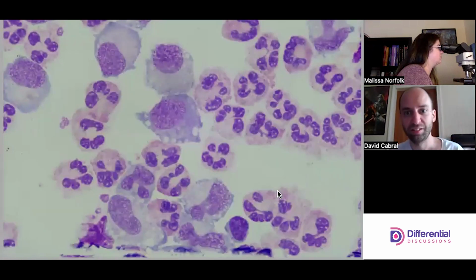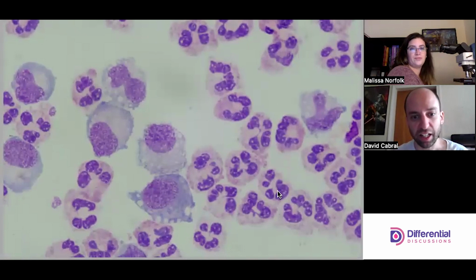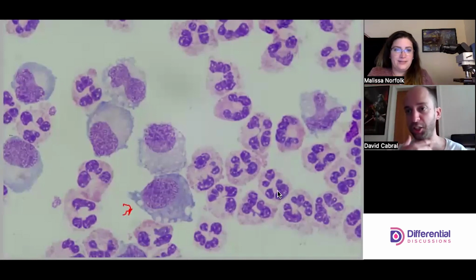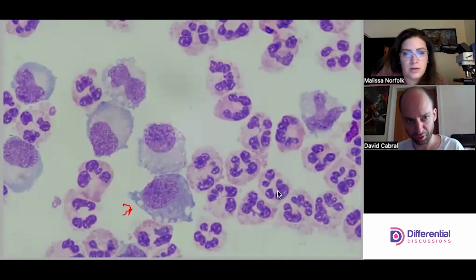I've got to be honest, these are the cells where I'm trying to draw a straight line. Those are the types of cells that are total judgment calls. And differing minds might feel differently. Given the darker color of it, I'm inclined to lean towards a synovial site, but it's tough. I don't know. What are your intuitions?